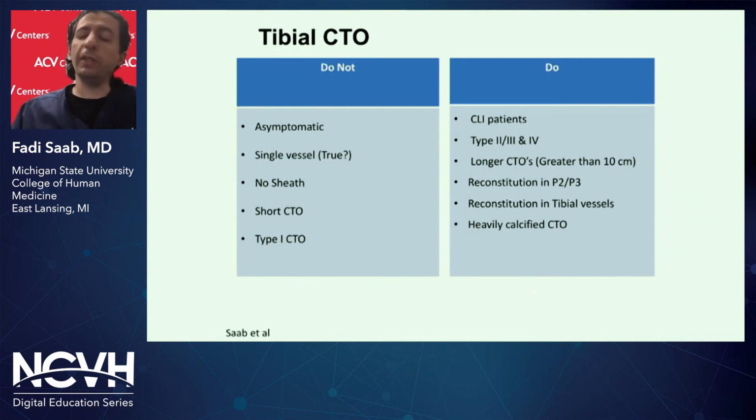But when would you use pedal access? Well, CLI patients, type 2 and 3, long CTOs, heavily calcified vessels, reconstitutions of CTOs within the tibial vessels, you must consider tibial access. In fact, you must start with tibial access with some of those cases.